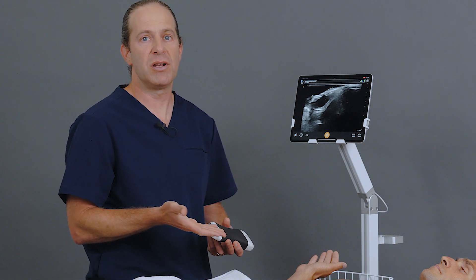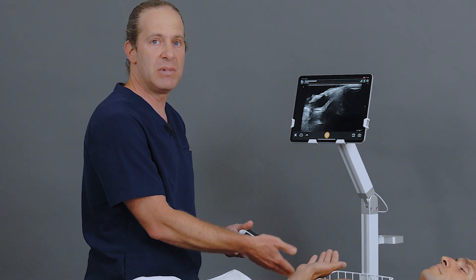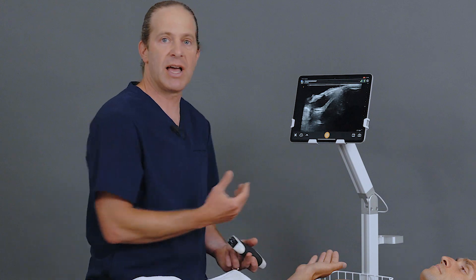I will often combine this with another forearm block if needed, particularly the median nerve block, depending on the distribution of anesthesia that I need.